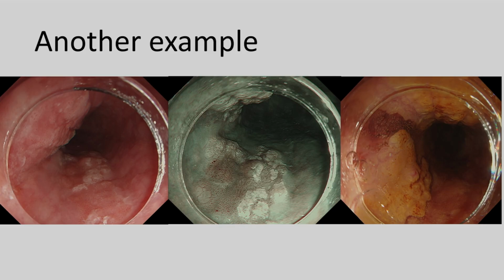Now, the next case shows the importance of Lugol's assessment. If you look at this area with white light, narrowband imaging does highlight this area here with elongated pits. I don't know what's happening with this nodularity here. So we threw some Lugol's and we identified that area where there is a tiny, tiny area of what we call the pink sign. That is where you need to focus on the biopsies. This is where the high-grade dysplasia / cancer is residing.